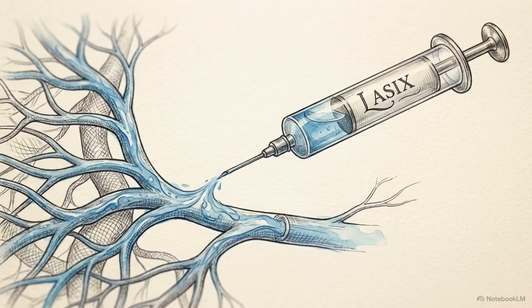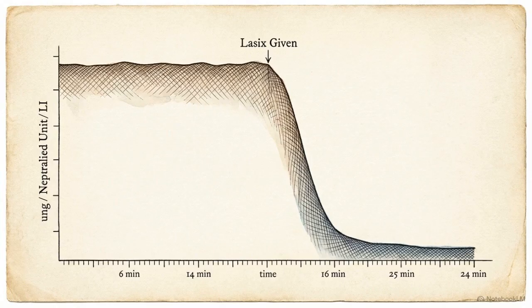Exactly 30 minutes after clearance begins, we administer a diuretic. A structurally compliant system will flush out when overloaded with fluid. A true obstruction will not. A normal, unobstructed system responds rapidly. Greater than 50% of the tracer will wash out within 10 minutes of administering the Lasix.